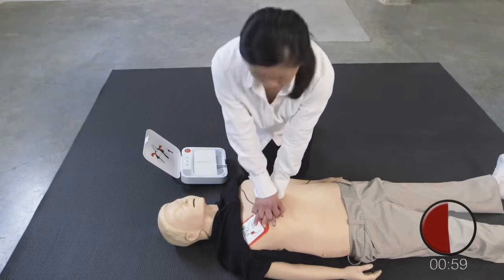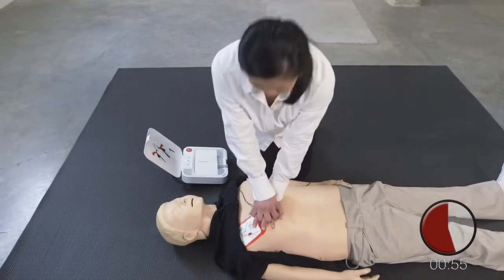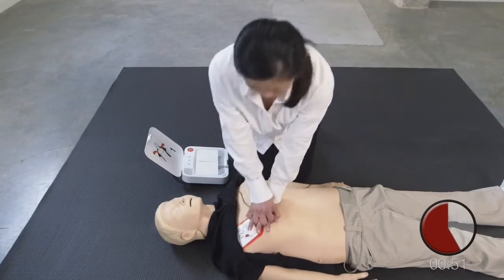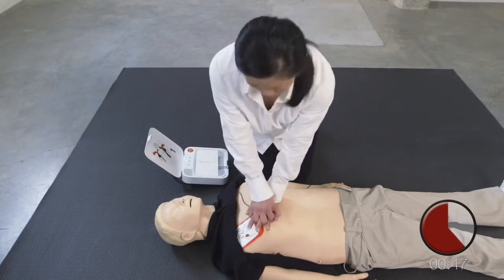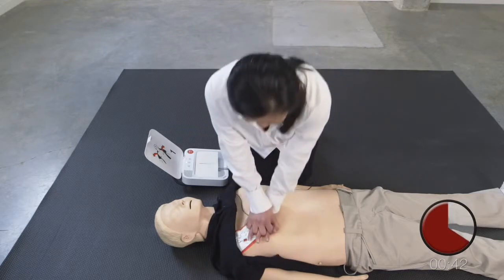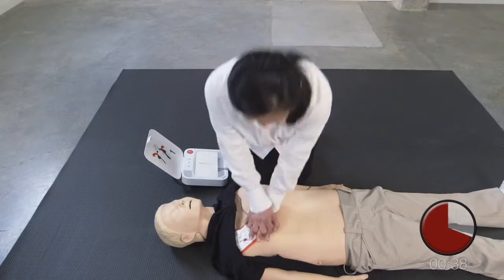Use body weight to push. Push down hard at least five centimeters. Remember to push hard.